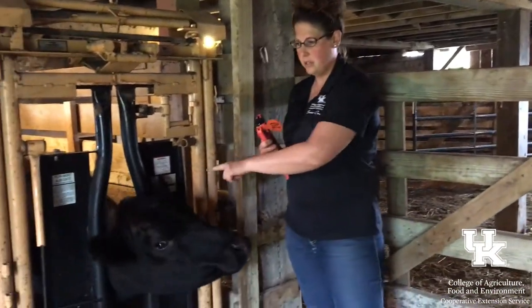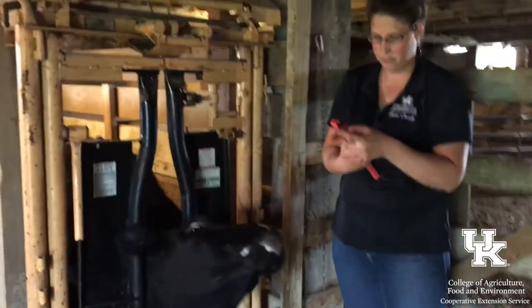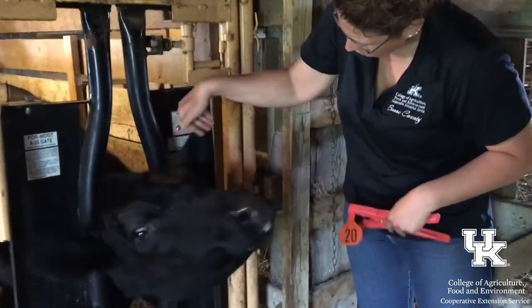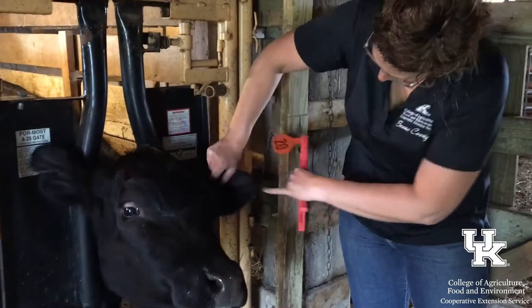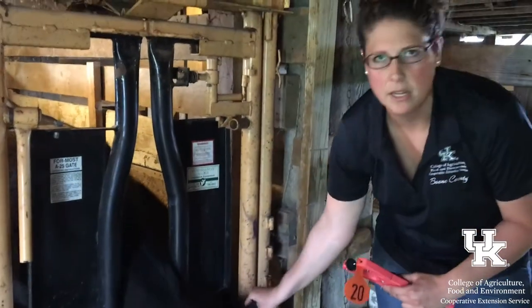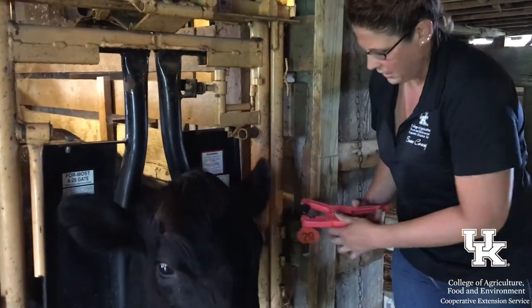I'm going to put the tag in this ear since the other one's ripped out, so I need to flip it around. When you're putting a tag in the ear, you can zoom in on this thumb — you can see these ribs. You want to go right in the middle. There are kind of three sections; you want to go right in the middle of that rib so you're missing any cartilage or anything like that that might hurt.